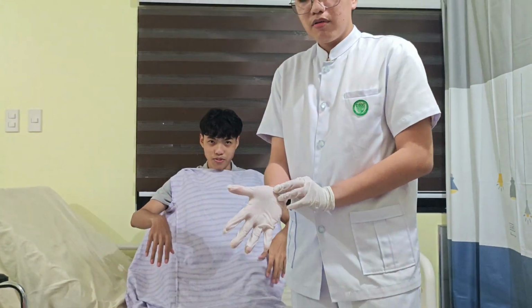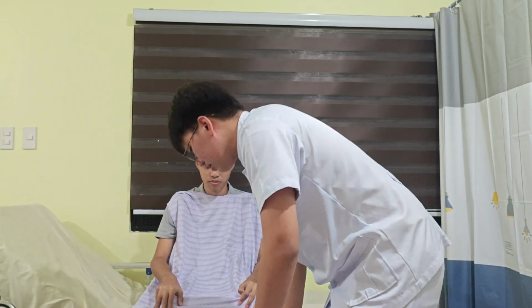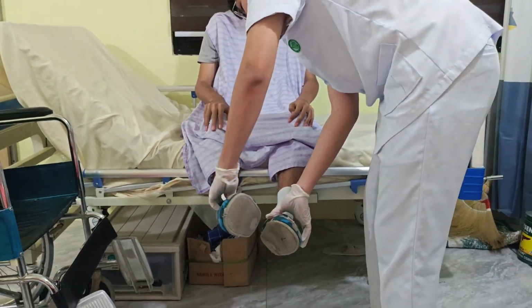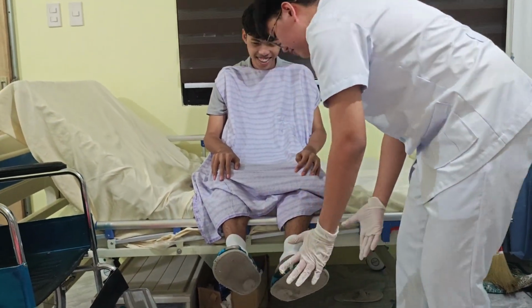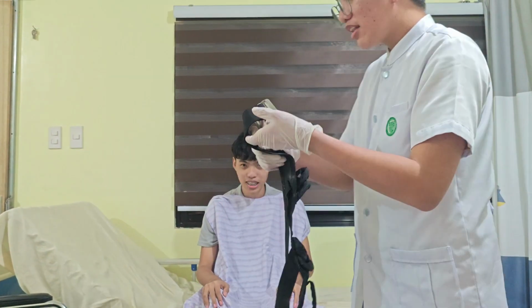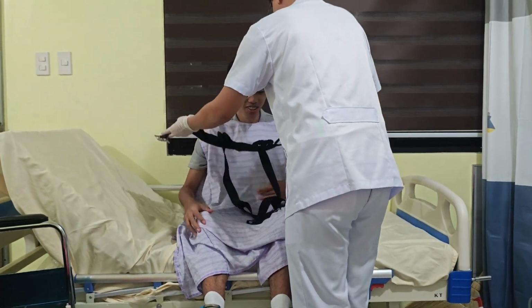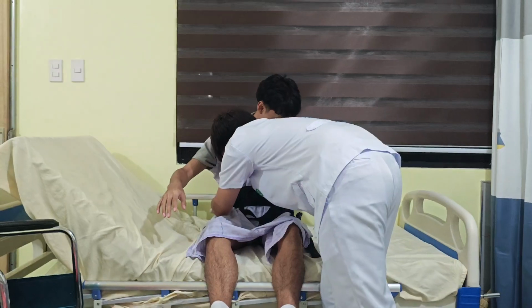After that, I'm going to give the patient non-slippery slippers. And after that, I'm going to give the patient a gait belt.